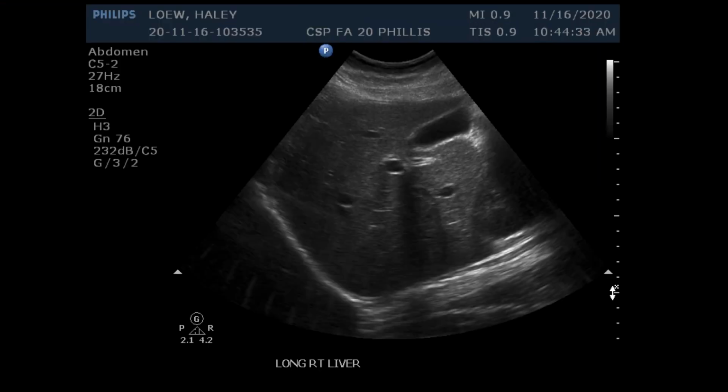For the right lobe of the liver, we must increase our depth. In our first image, the gallbladder, portal vein, and main lobar fissure should be shown. The diaphragm should also be bright. I was experiencing some artifact with my machine during this scan, and that is why it looks like it is snowing in the bottom left. I also could have shown a better MLF.